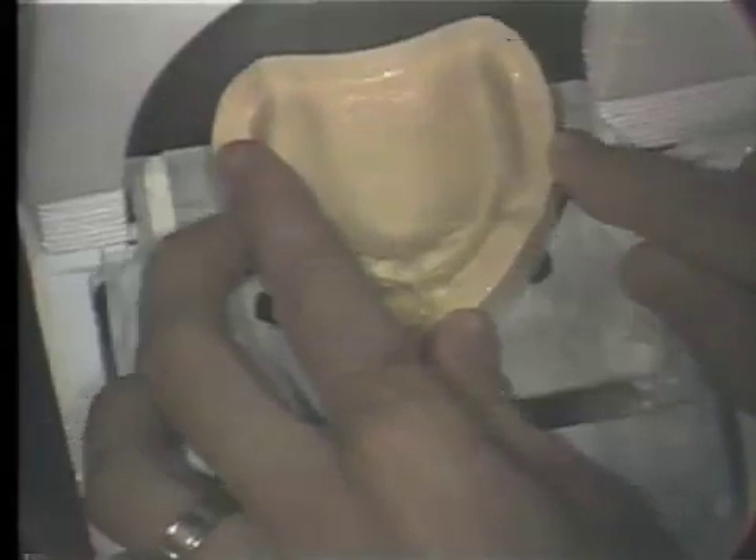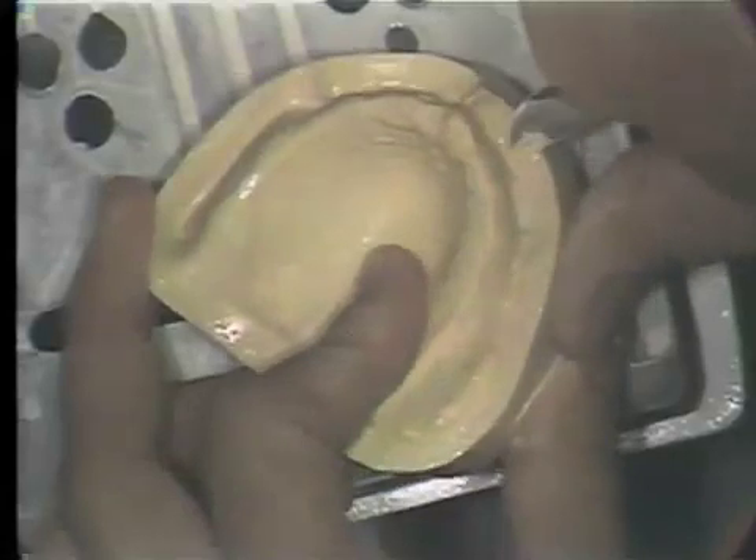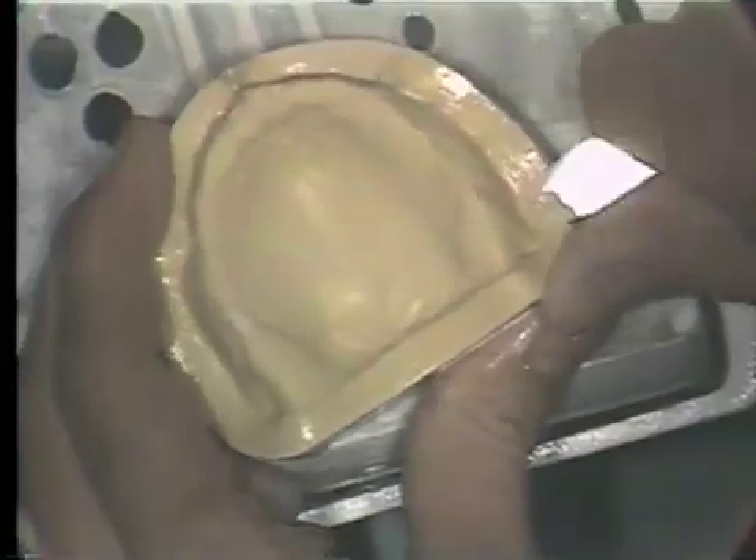Moving this around, trimming across the posterior border, around in the buccal flange area, adjusting this landing area until it is uniformly approximately one quarter of an inch. At this point, we can do the final trimming of the landing area and adjustment with our sandpaper to smooth out this area and adjust any discrepancies with the laboratory knife that might still be present. After having trimmed both the mandibular and the maxillary model, we can set them aside to dry in preparation for the next step in complete denture construction.